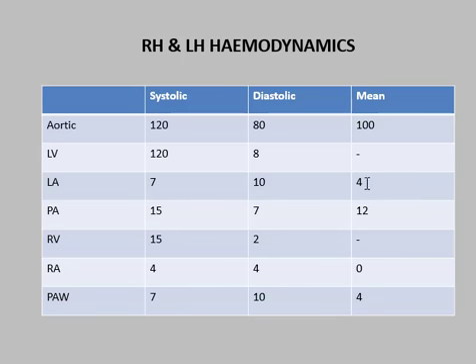Pulmonary artery, normal population values are 15 systole, 7 diastole, and 12 mean. Right ventricle, again, same as the pulmonary artery if there are no stenotic pathologies across the pulmonary valve. Pulmonary artery is 15 systole, 7 diastole, and a mean of 12. The right ventricle, 15 and 2.